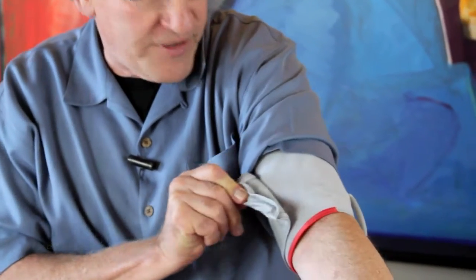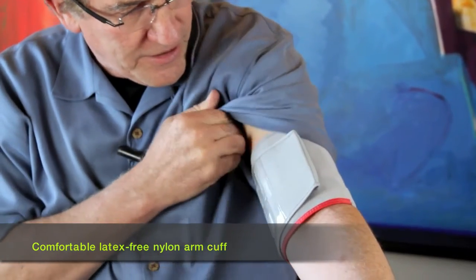This is a blood pressure monitor made to work with an iPhone — iPhone 2G, 3G, 3GS, or iPhone 4. And it consists of a cuff, which I've already put on. See right here? A blood pressure cuff with Velcro. Put it on my arm.